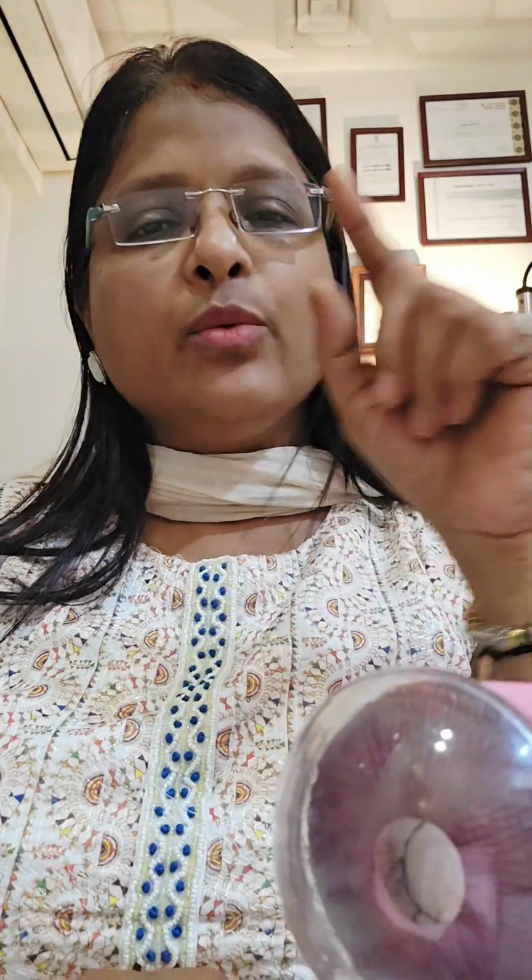So to alleviate this, we got the trifocal lenses. Trifocal lenses are a step ahead in technology as compared to multifocal lenses. They are said to have fewer side effects, but still there are some with trifocal also. And all the rest is better in trifocal, like contrast sensitivity, depending upon which type of trifocal we are implanting, which technology it is made with. And depending upon that, we have other benefits in trifocal, like night vision is good, night driving may be good, but trifocals also do have these photic phenomena, to a lesser degree.